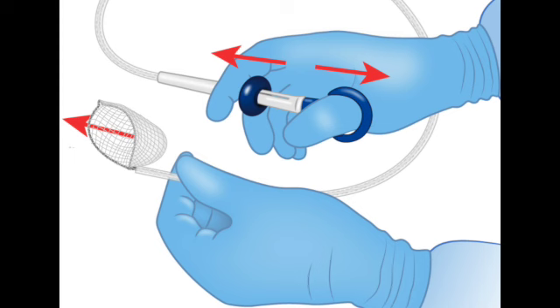Spot on. If getting a definite assessment of the resection margins is critical, meaning, did they get all of the potentially problematic tissue right up to the edges, then just dropping it in the jar isn't quite enough. Why not? What happens? Well, think about it. You take this three-dimensional, often floppy piece of tissue and drop it in liquid formalin. It tends to curl up, fold onto itself. It loses its original shape and orientation. And that makes it incredibly difficult, sometimes impossible, for the pathologist looking under the microscope to figure out which edge was which. They need to know the true relationship of the tissue to where the cut was made. Was the cut clean, or was abnormal tissue left behind right at the edge?